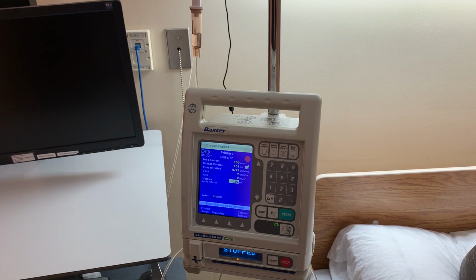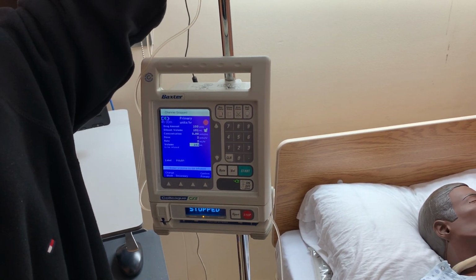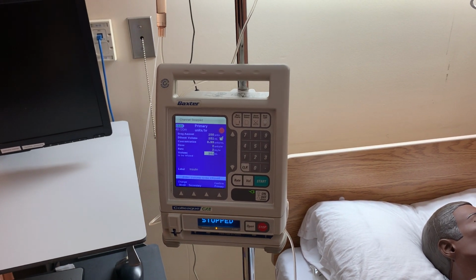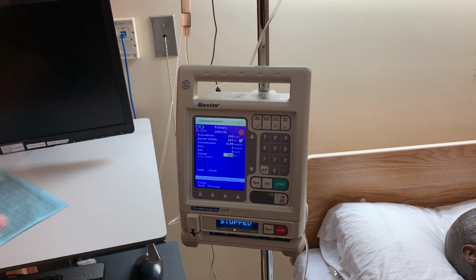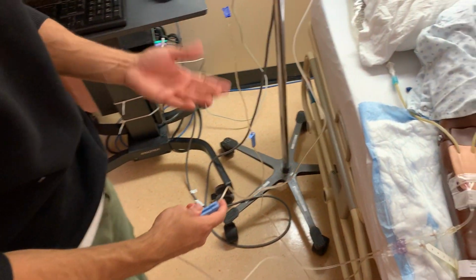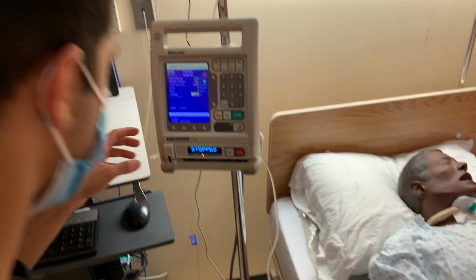And actually, before I confirm primary, I'm just going to get my second buddy nurse to come and check over the pump and the bag and everything, make sure everything is good. And once the buddy nurse has confirmed everything, I'm just going to be confirming primary, and then making sure all my clamps are open. Now all my clamps are open.